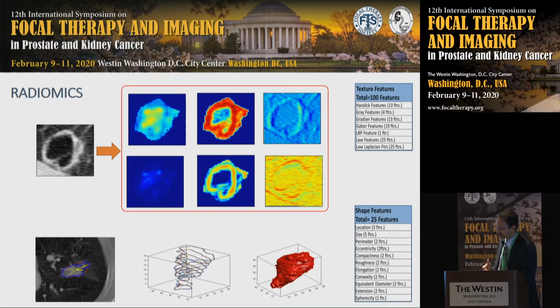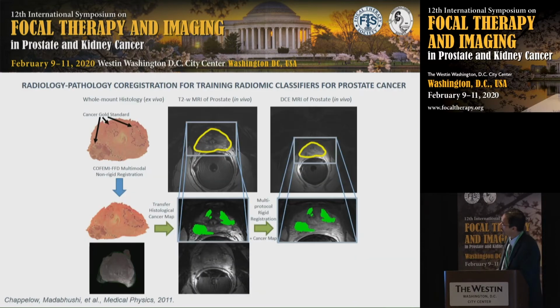A lot of these texture-based features were developed actually in the early 70s and really have become the mainstay of what we call radiomics, fundamentally using mathematical operators to go in and characterize heterogeneity patterns on radiographic images and really extract or prize out texture-based measurements or texture-based responses. One can, of course, also start to look at shape-related attributes of the disease. The beauty is with these operators, one can really transform the radiographic image into a series of quantitative measurements that now reproducibly describe the morphology of the disease.